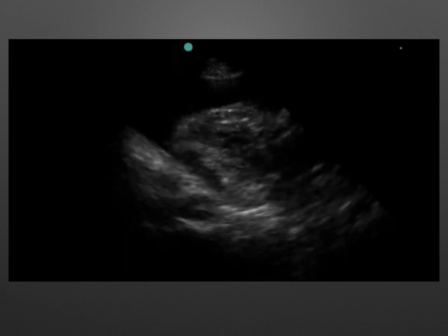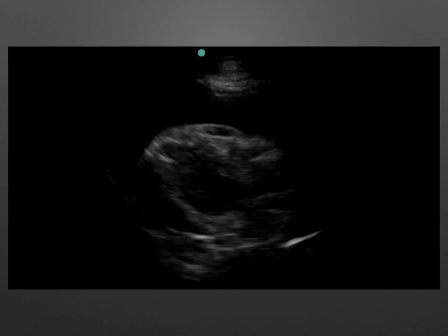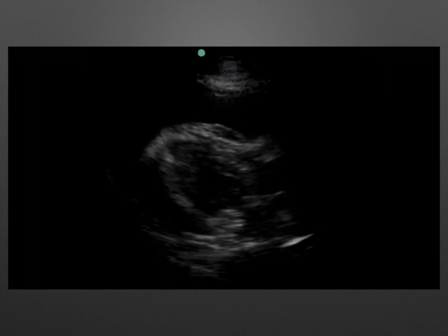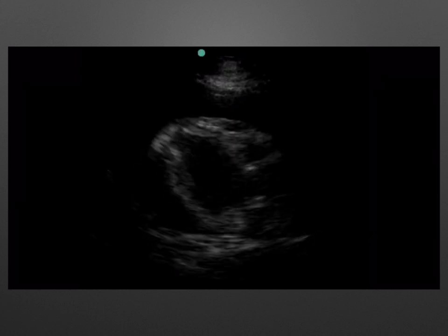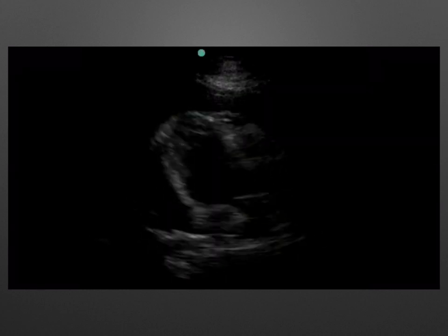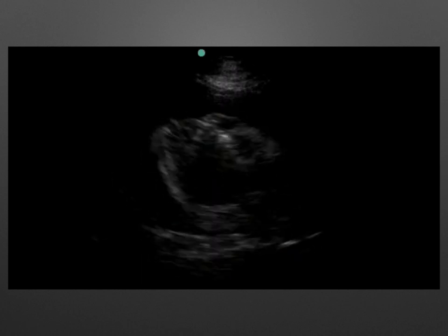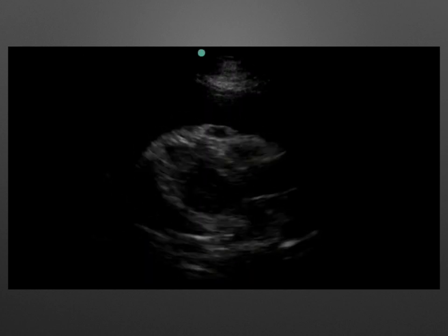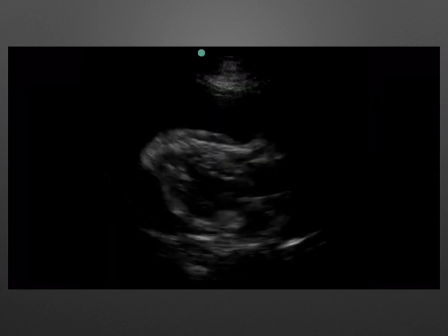In this image, we have an even larger pericardial effusion. Here you'll note that this is a very big pericardial effusion, and you can see the heart kind of swinging back and forth within it. This is the phenomenon that leads to electrical alternans. This is where the QRS axis alternates between beats, and it's a sign of a severe effusion or even tamponade. Essentially what you're looking at is the heart wobbling in the fluid-filled pericardial sac.